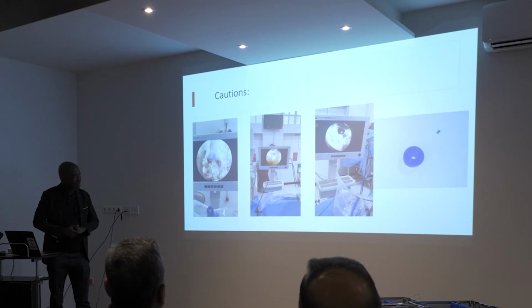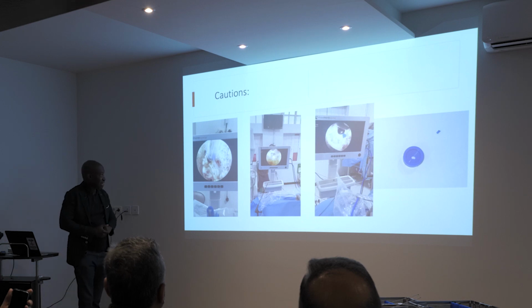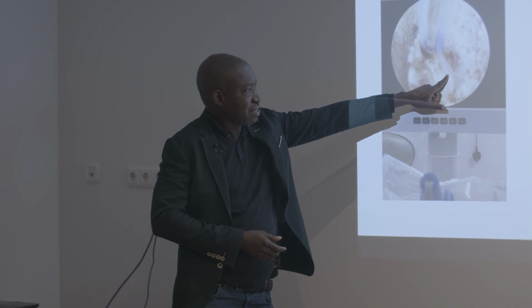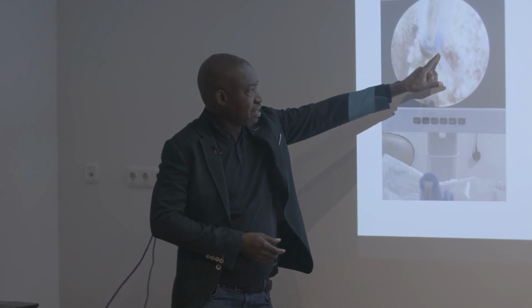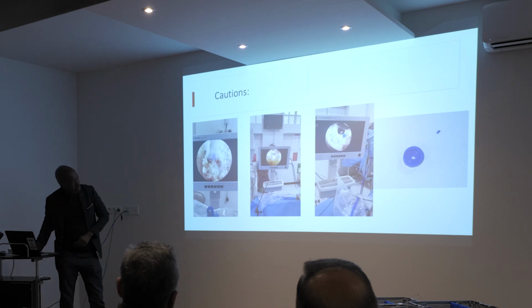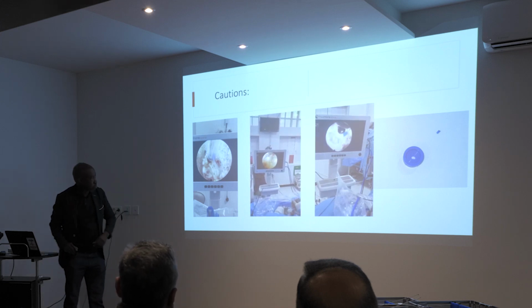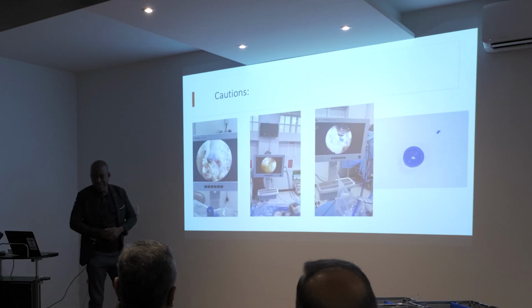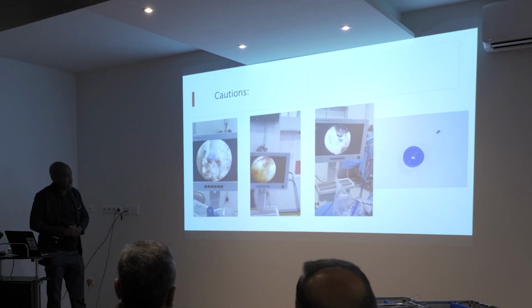All the same, we have to be a little cautious. Like here, we can see our RF is getting detached, and this piece can stay behind. Or here, our tool got broken, the piece of the tool. So you can have instrument breakage.